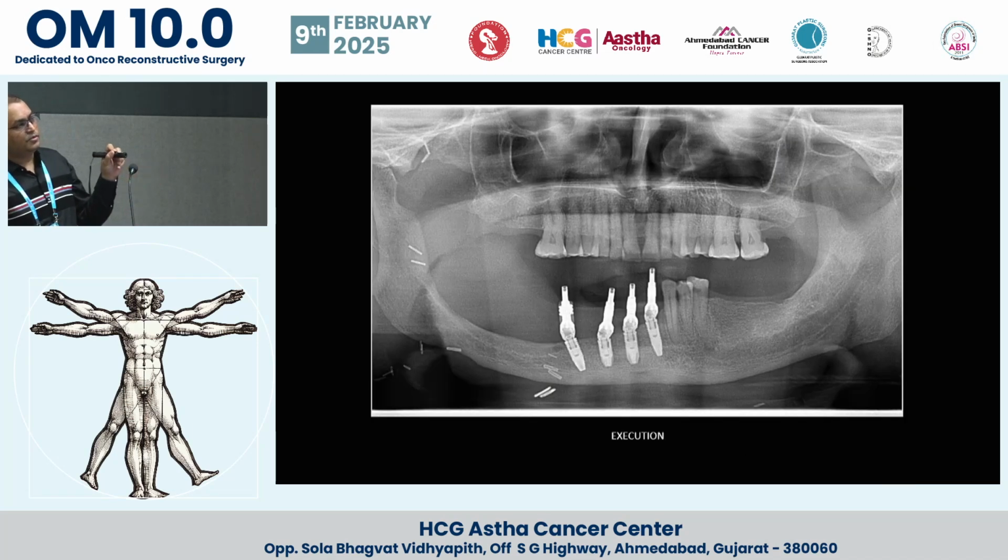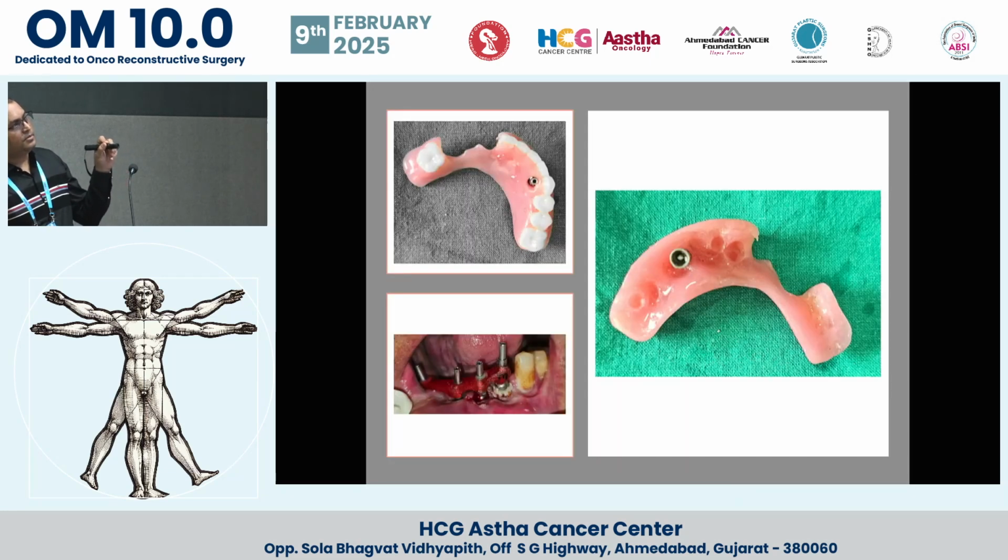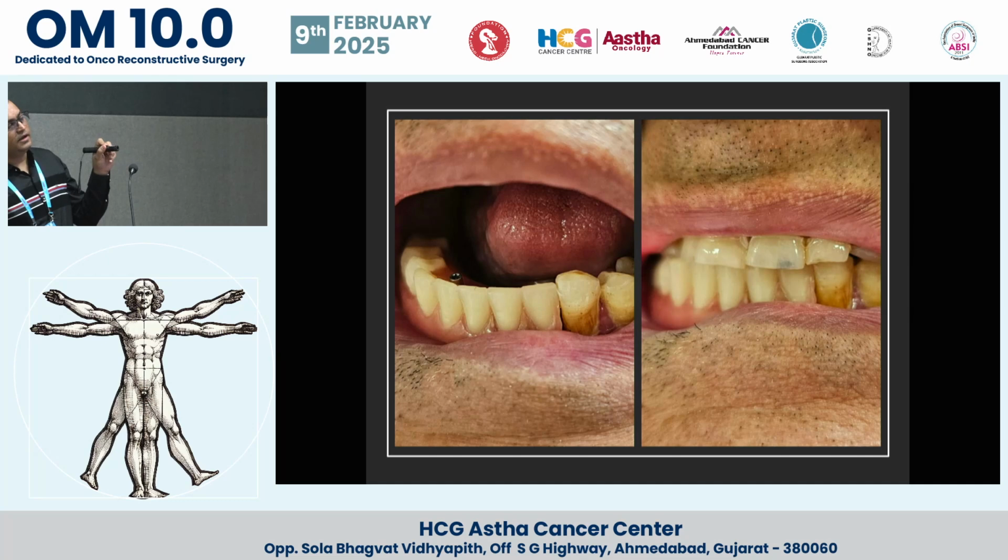So this is immediate post-operatively. This is the mental foramen, and the implant is lingual to that. This is the temporary prosthesis. This is the final prosthesis.